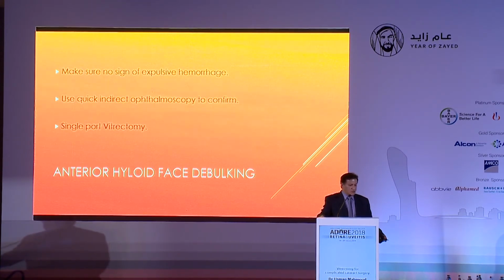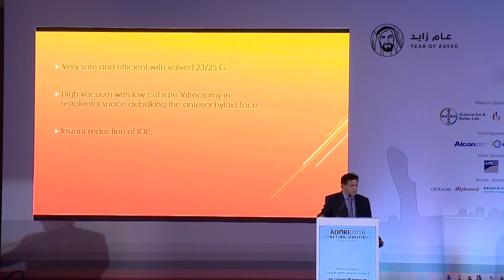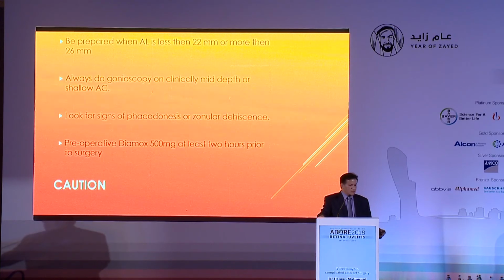So in this kind of situation, you need to make sure at that point in time that there is no sign of expulsive hemorrhage, and a single port vitrectomy quickly debulks the anterior hyaloid face, and it's very efficient with 23 gauge.